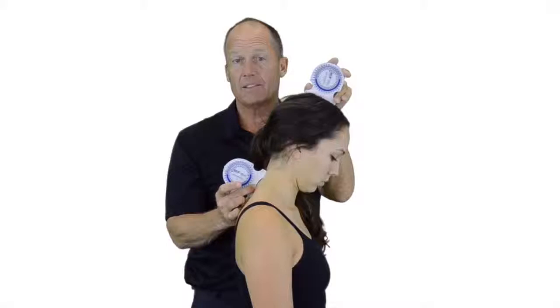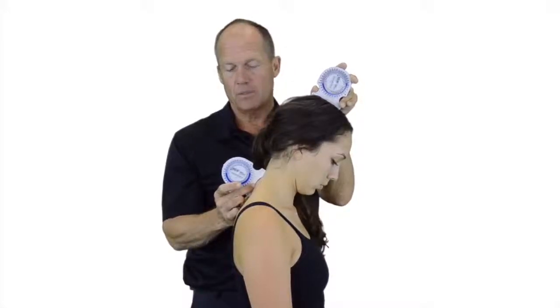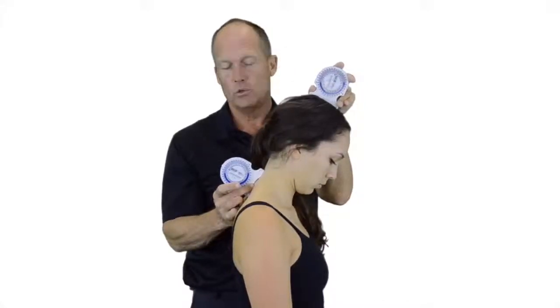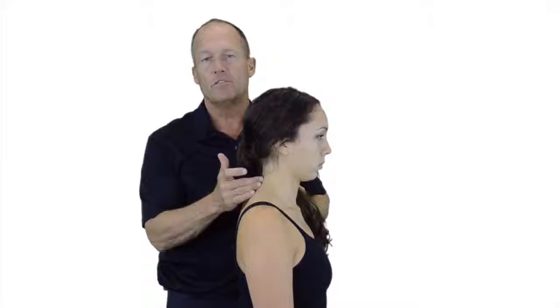As I instruct the patient to slowly flex forward, I am palpating at T1's spinous process for motion. As I feel that motion occur, I would end the measurement, take a look at the two different angles, and the difference between the two values would give us a measurement for cervical flexion.